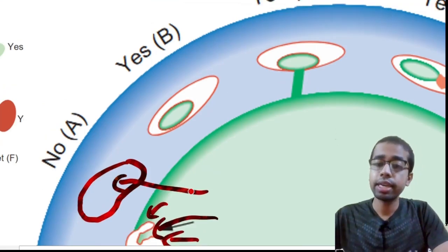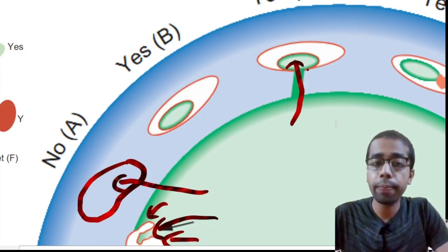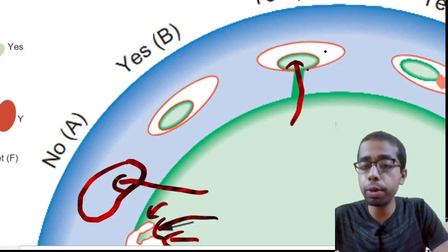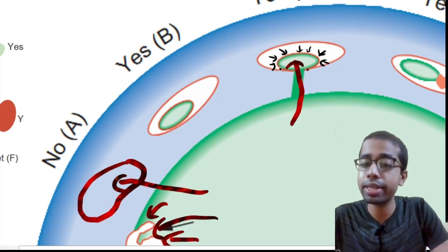Second, if the tumor is penetrating the vessel which is there in the fibrous capsule, the tumor part has to be lined by endothelium. Very, very important. Can you see an orangish hue? Yes, it is nothing but the endothelial lining present around the tumor part.